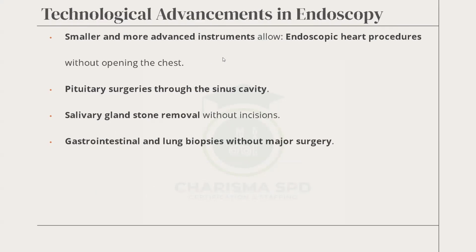Smaller and more advanced instruments allow endoscopic heart procedures without opening the chest.